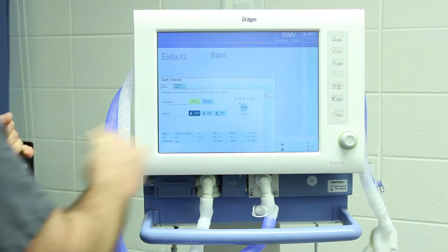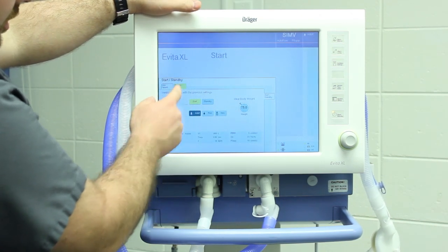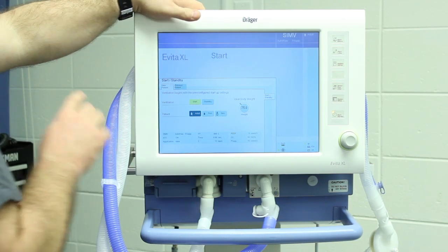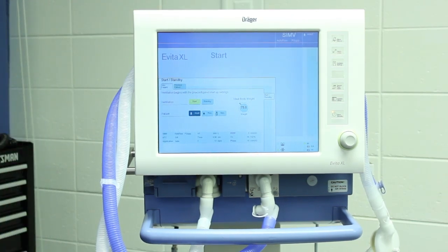The initial startup screen comes up in standby — it's easy to activate, just hit this and go. If you want to enter a previous patient or put in a new one, you can select peds or neo, which will limit your tidal volume settings. Generally, just leave it on adult, hit start, and go.